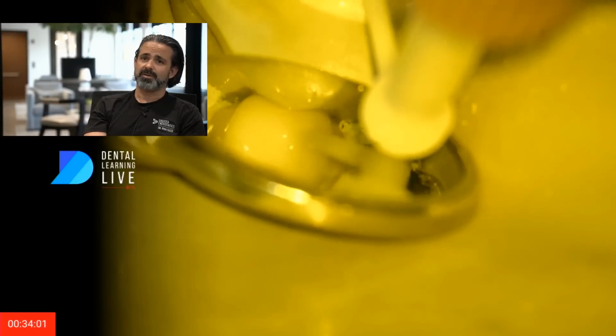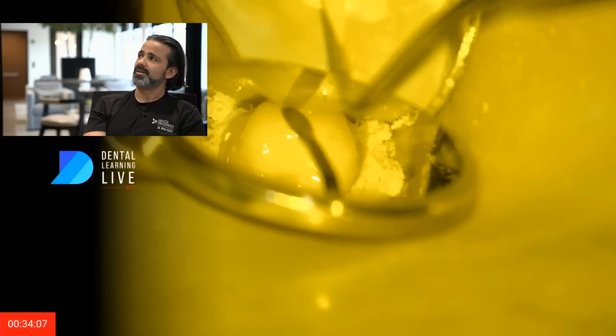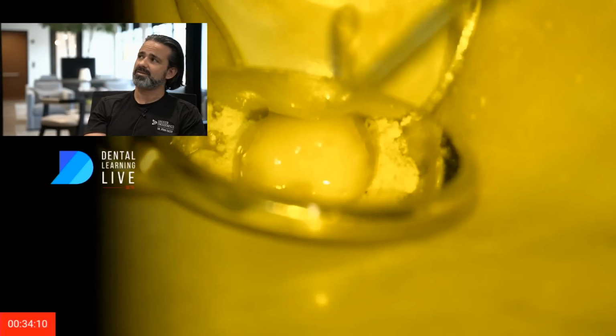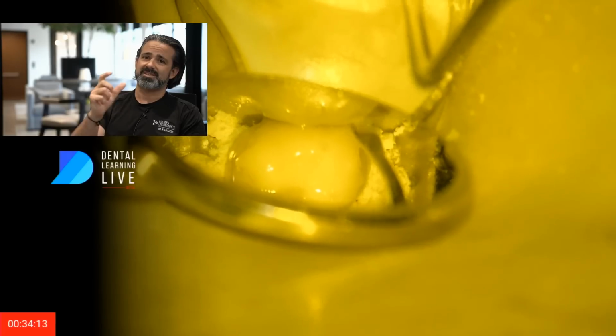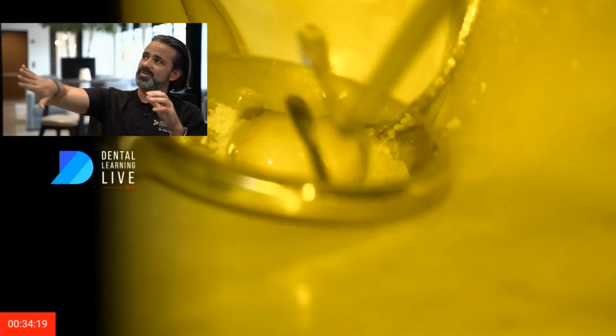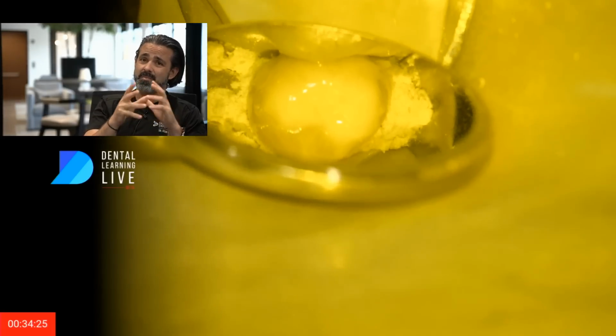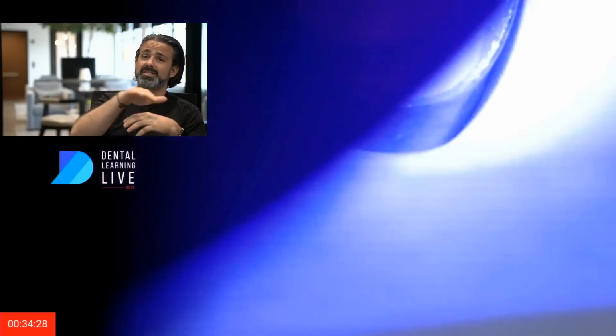And you can do incremental layers, and it's definitely advised to do that. And again, when I can get in on a lot of surfaces, I'll do that. Just like I kind of said with the sound seal, you let it get kind of semi-set. You just let the ambient light work it. Don't go right into adjusting and smearing it on that class 2 wall until it gets a little bit semi. It's kind of hard to explain, but it just starts to thicken up. It's actually easier to do that little manipulation. Now, I can't manipulate very much, but I'm just dragging it. I want to make sure those margins are closed. That's why. Do a couple more cures. 34 minutes into it.